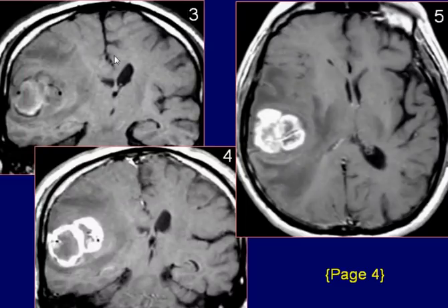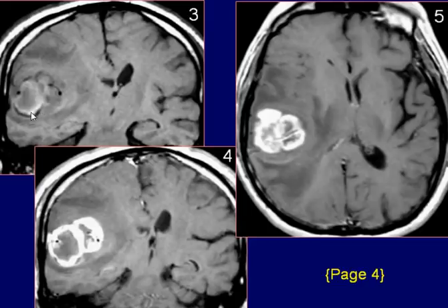Coronal T1-weighted images of the brain reveal a ring-like high-signal intensity area within the lesion, which is likely due to subacute hemorrhage.